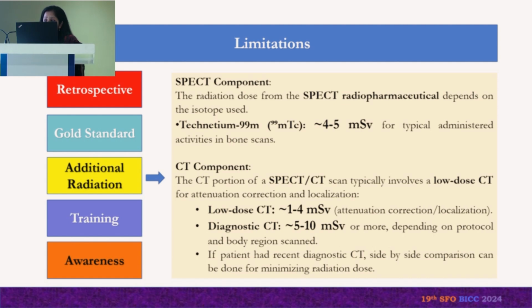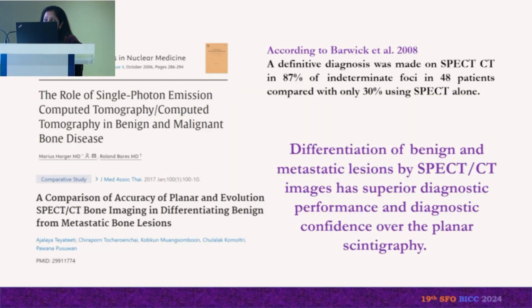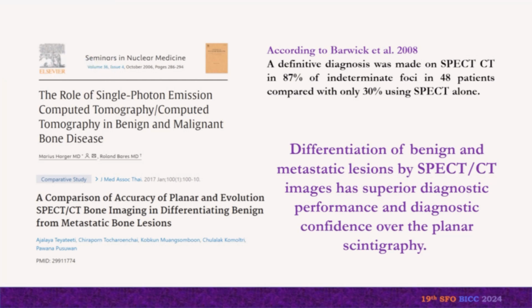And of course, training is necessary for SPECT CT imaging, and awareness. These are some reference articles which we used in our study that show that differentiation of benign and metastatic lesions by SPECT CT imaging has superior diagnostic performance and diagnostic confidence over planar scintigraphy.